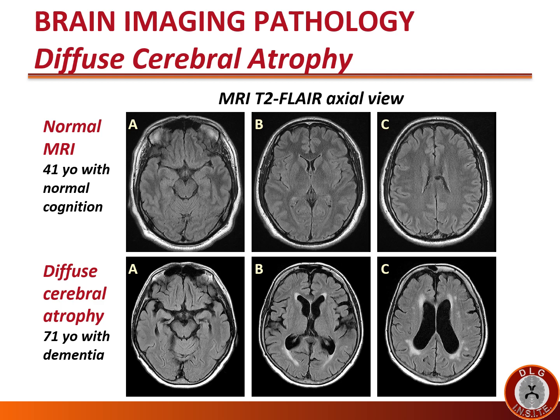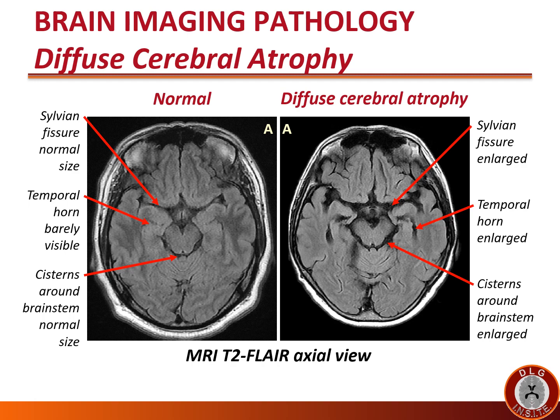Now let's appreciate the appearance of diffuse cerebral atrophy on brain imaging, comparing MRI FLAIR axial images in a 41-year-old with normal cognition versus a 71-year-old with dementia. In the normal patient, the sylvian fissure is normal in size, the temporal horn is barely visible, and cisterns around the brain stem are normal in size. In the patient with dementia and atrophy, the sylvian fissure and temporal horn are enlarged, and the cisterns around the brain stem are more prominent.